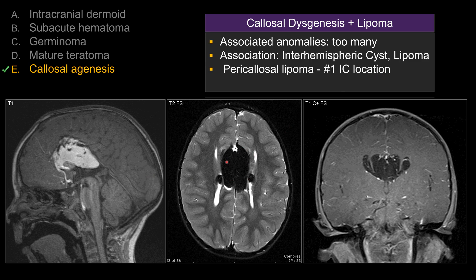In this case, you have a large pericallosal lipoma, which may throw you off a little when you first look at the case. With pericallosal lipoma, the pericallosal location is the most common location for intracranial lipoma.